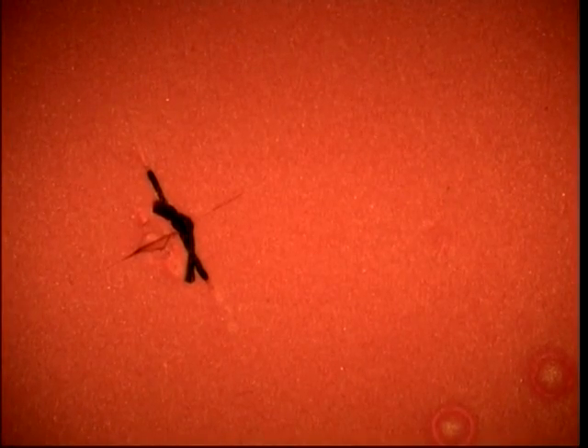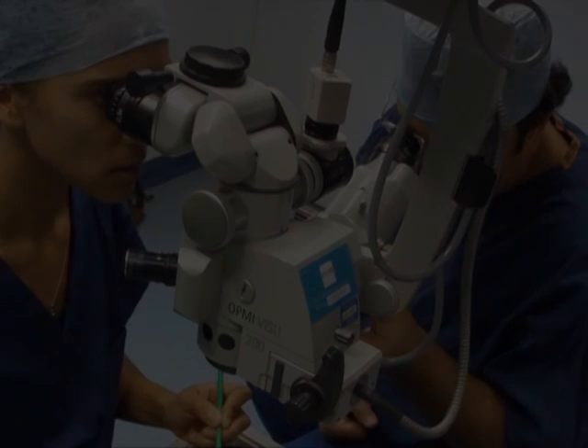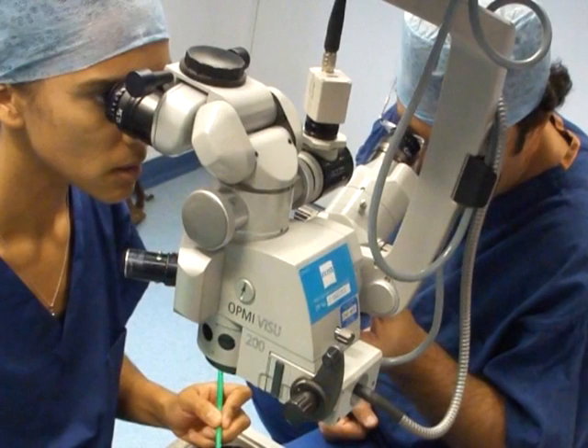For skin stitches, leave the knot at one end on the surface. Now we will modify that basic technique for intraocular surgery, and suturing a wound in the cornea, or the sclera.